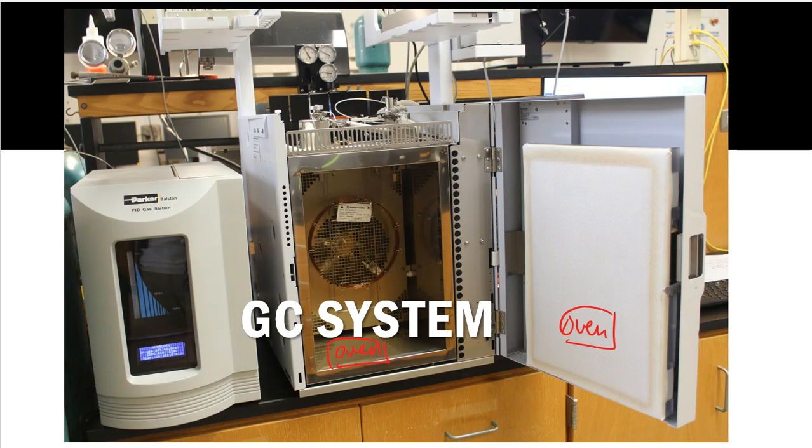So the oven is actually a heated chamber. And I'm going to draw a triangle here. And that triangle represents heat. And when this instrument turns on and begins to run, this will be a heated area of the machine. And we can heat it really hot, and we can heat it maybe just at room temperature or slightly above. We get to control that. That's us as a user, and that will all change depending on what we're trying to analyze.